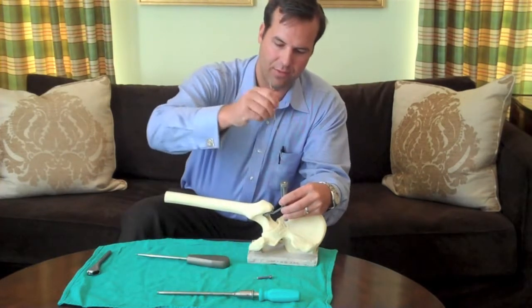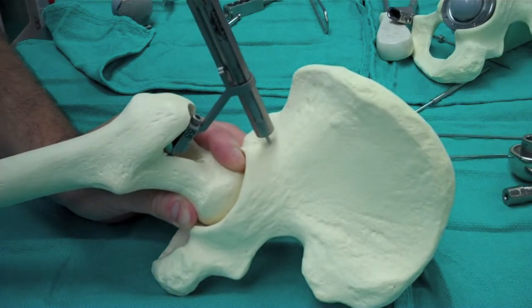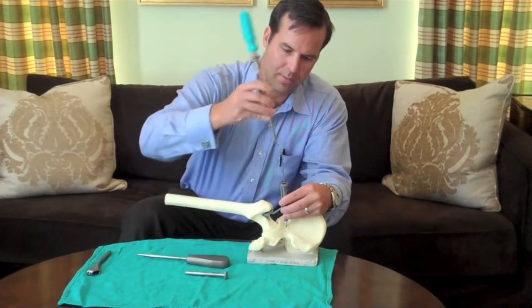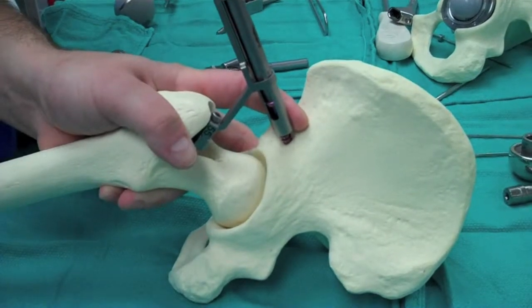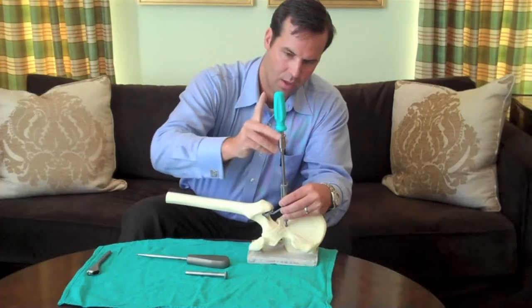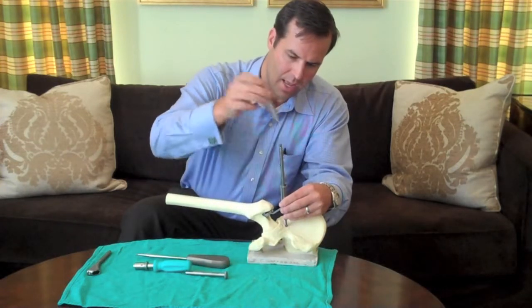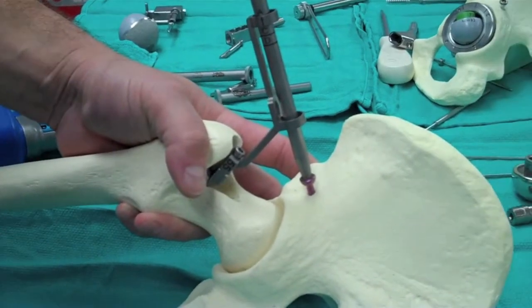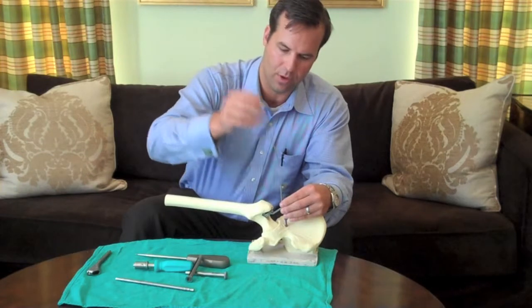The guide wire is inserted exactly 55 millimeters above the shoulder of the prosthesis, and once that guide wire gets inserted, we insert a cannulated screw over that guide wire to mark our secondary reference point. The screwdriver here has four scribe lines, and the surgeon just stops when one of those scribe lines is at the top of that ring, and that helps determine their preoperative offset.